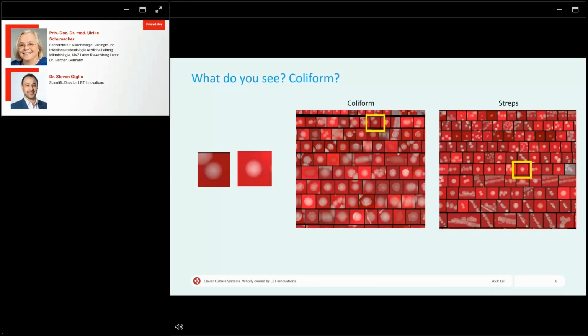This overlap that occurs in an AI system is important to recognize, but it's also a limitation of the technology. I think we've all had bench experience showing people a colony or a growth on a plate, and not everyone would get the correct answer. Is it an E. coli? Is it a Citrobacter? Is it an Enterobacter? There are different ways that humans interpret that, and this is part of our challenge as an AI company, to develop that common understanding through microbiology and AI.